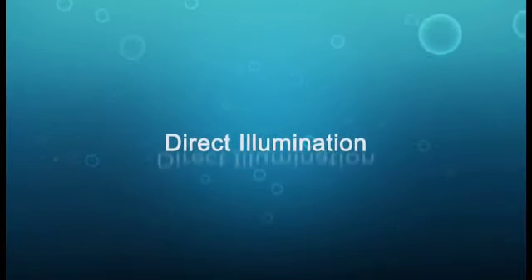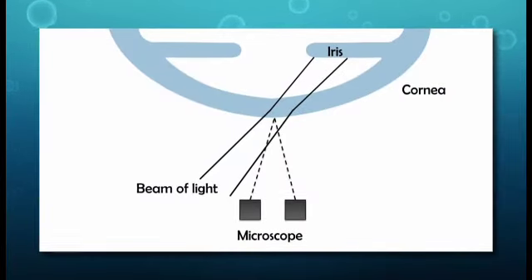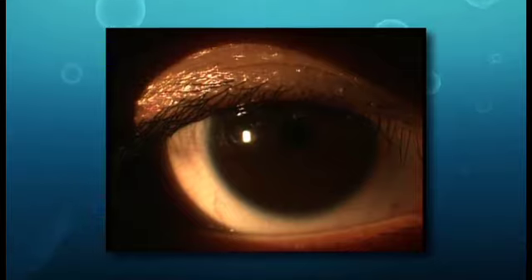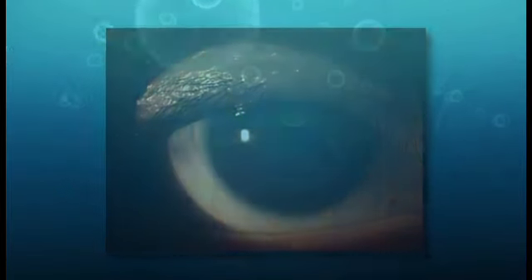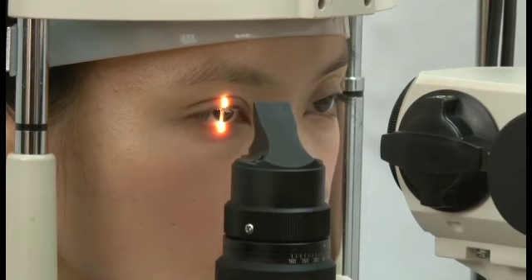The second type is direct illumination. The light source and observation focus coincide on the same spot on the eye regardless of the position of either system. Direct illumination can be subdivided into the following techniques. Parallelepiped.